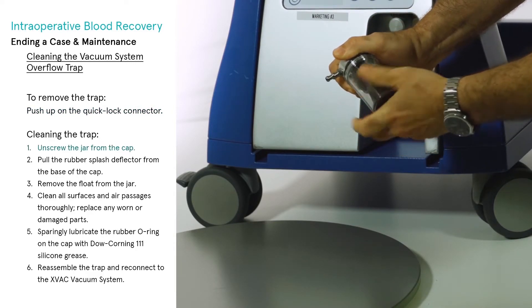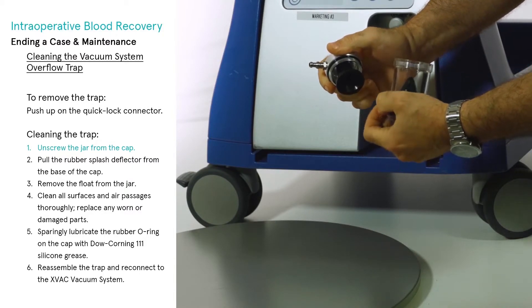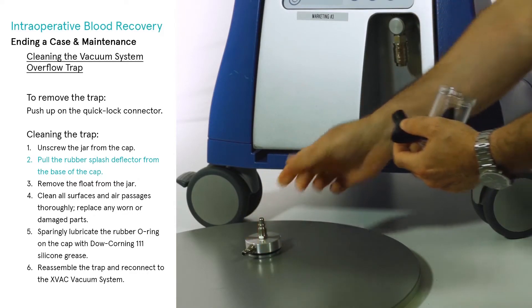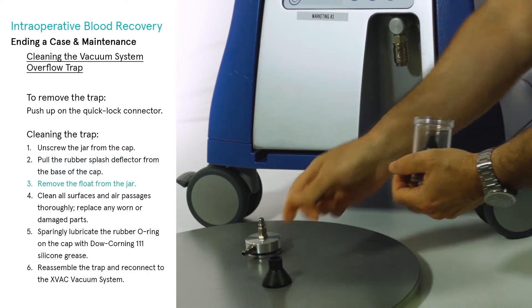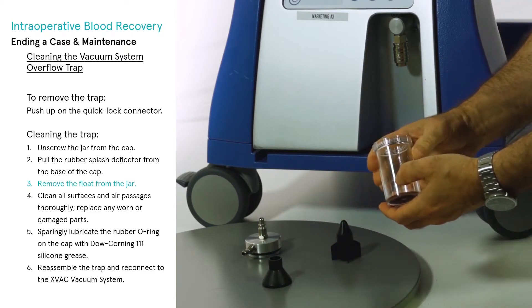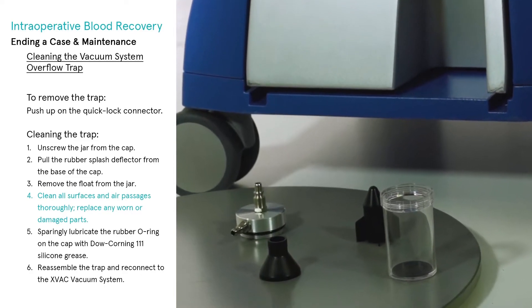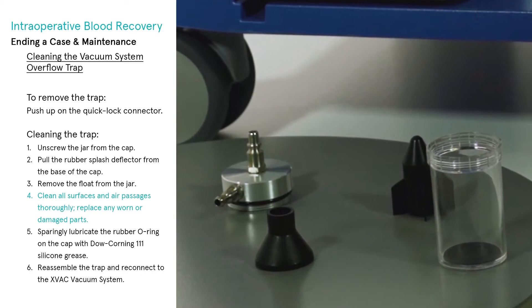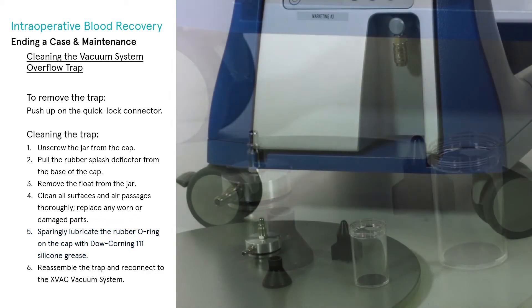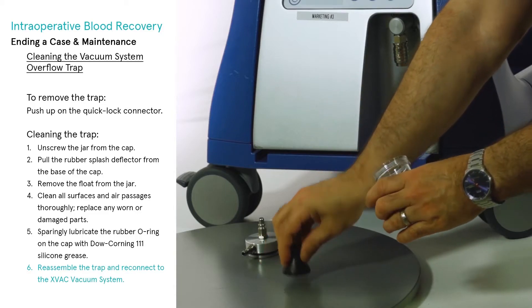After removing the trap from the x-fac, do the following: unscrew the jar from the cap. Pull the rubber splash deflector from the base of the cap and remove the float from the jar. Clean all surfaces and air passages thoroughly and replace any worn or damaged parts. Sparingly lubricate the rubber O-ring on the cap with Dow Corning 111 silicone grease. Finally, reassemble the trap and reconnect to the x-fac vacuum system.